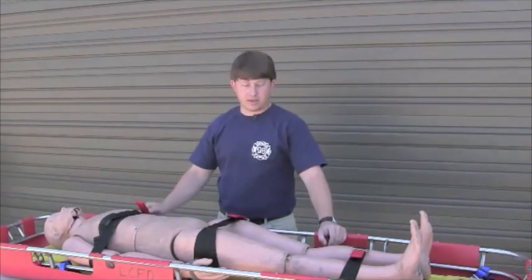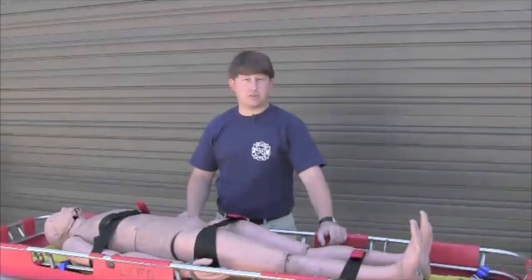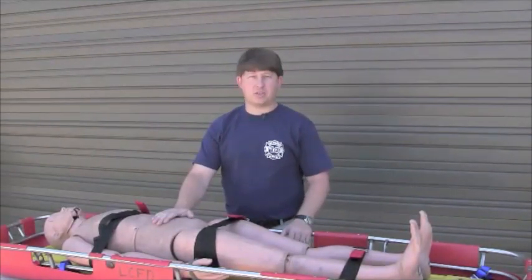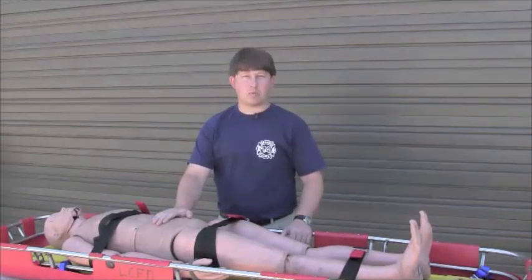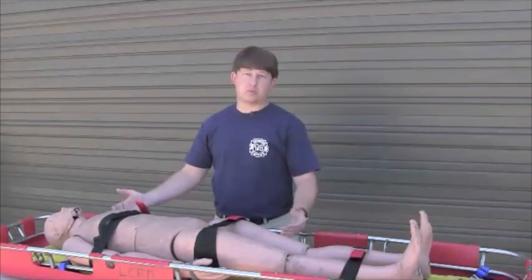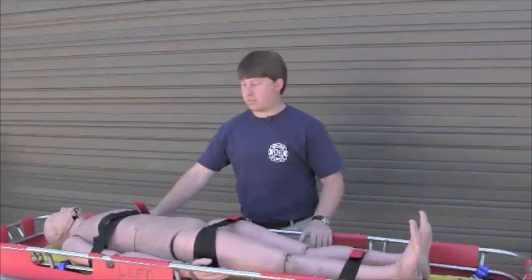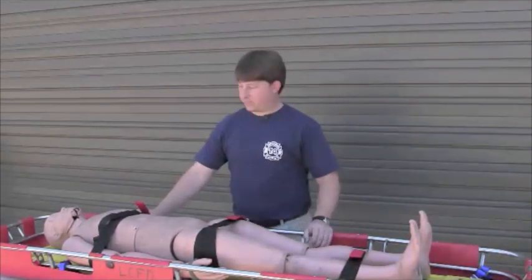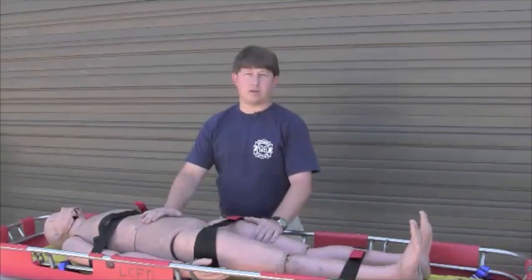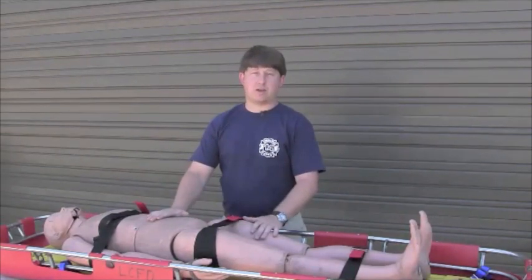The first device I'm going to go over today is the traditional Stokes basket, something that we would use for high angle rescues as well as simple low angle rescues. This basket already has our patient in it. The patient is on a backboard and attached to the backboard. We obviously want to make sure this patient might need spinal considerations, C-spinal mobilization — but I'm not going to do that today. I'm just going to consider this patient to be spinally immobilized and packaged, and then we're going to start packaging into our device to carry this patient.